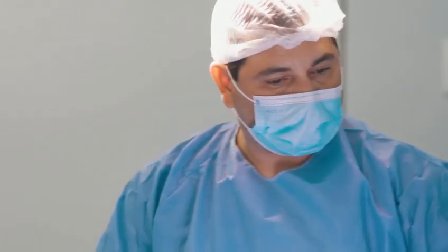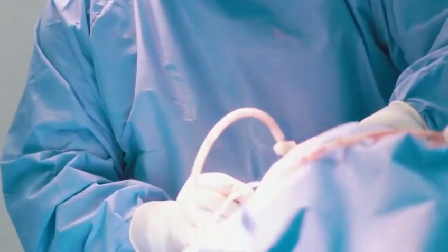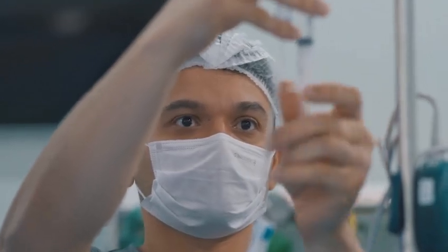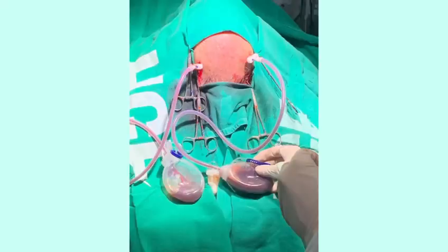Betadine ointment should be applied around the port operative site, followed by light dressing. The vacuum bulb should be clipped to the patient's gown, and the silicone tube may be taped to the skin to prevent disconnection. Post-op care.